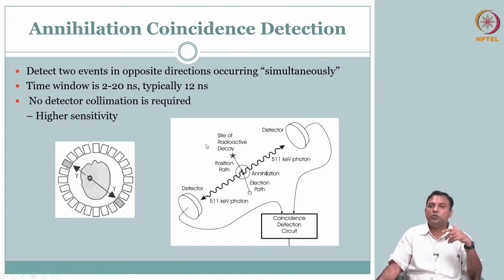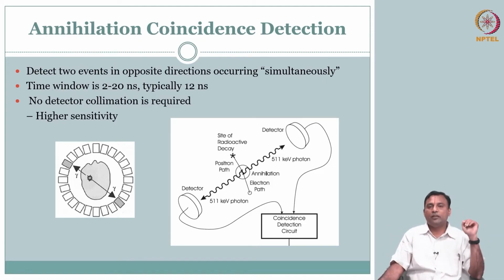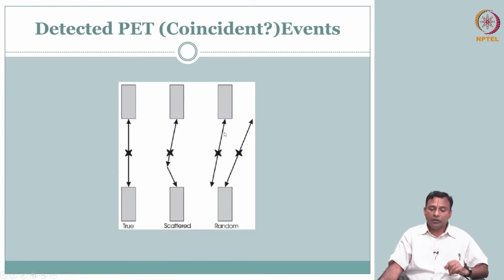So I do not need to really use the same, say we talked about sodium iodide with thallium. We do not really need to use a generic one that can be ready for different radio tracers. I can actually get something very fine tuned and efficient for your 511 kilo electron volt, and therefore the detector here is slightly different. Instead of using just the Anger camera with one crystal, which is the head that you saw, so big, here we could do a little better because of the known requirement.